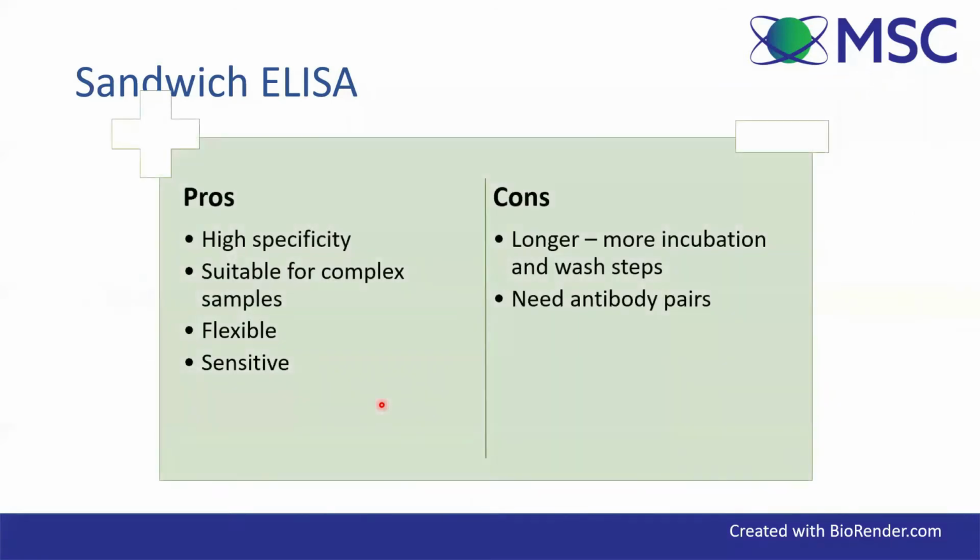read this. So some pros for this: it's got high specificity, it's suitable for complex samples, it's very flexible and it's very sensitive. Obviously, the cons are it's longer because you've got more incubation steps and wash steps, and obviously you need antibody pairs.